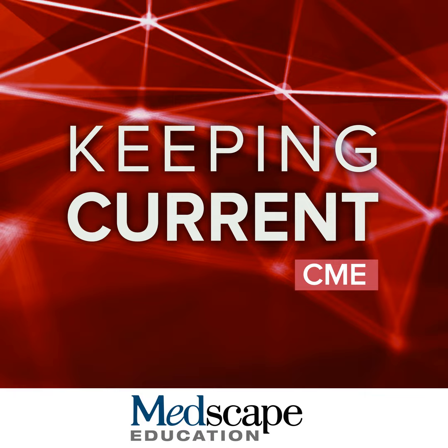For my own system, what happened is we're geographically spread out across Missouri and Illinois. And I don't have 3T scanners with SWI across the 300-mile radius that we cover. And so what we decided to do was obtain the 3T, SWI, and GRE at the baseline visit, and then do the monitoring at their community sites using 1.5T usually.